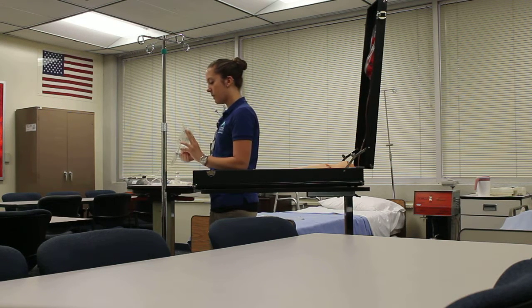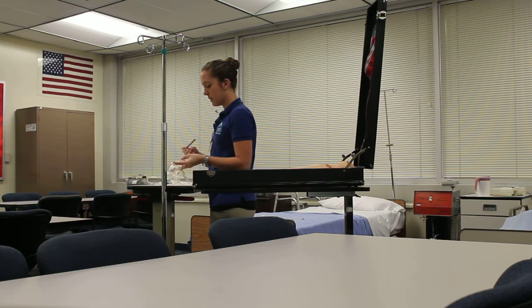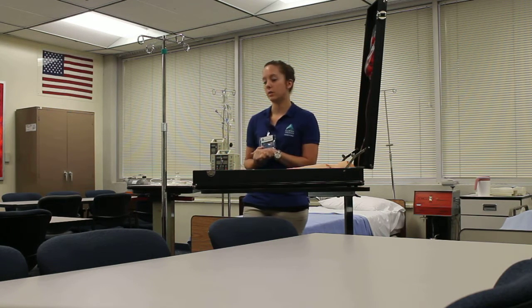I'm going to wipe off the bag tube with an alcohol swab and inject my medication. And then I'm going to throw my needle in the sharps. I want to go ahead and label my bag. I want to put the patient's name, the drug, the dose, the route, the time, and my initials.